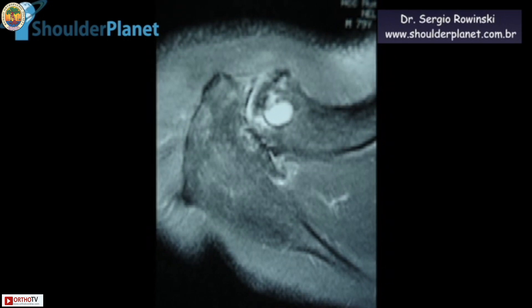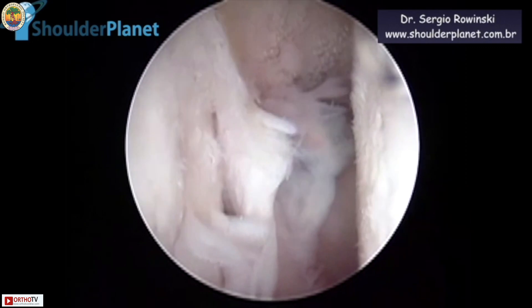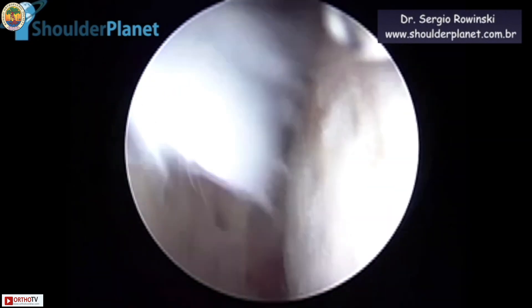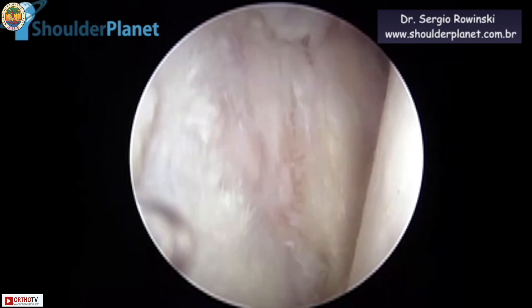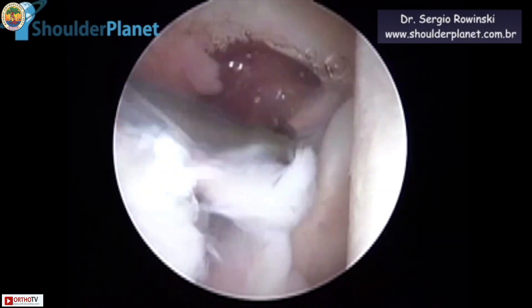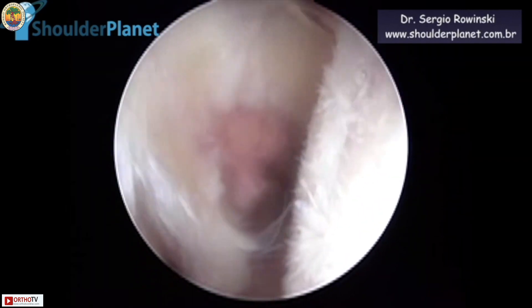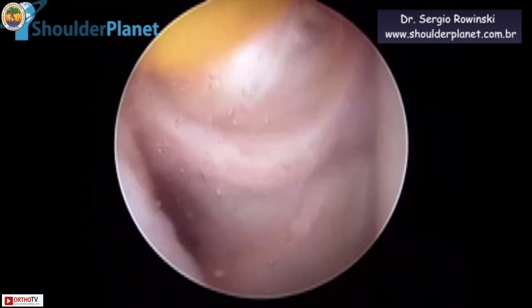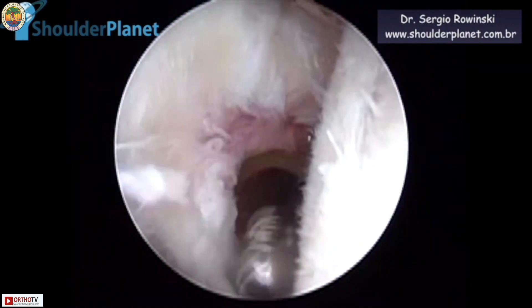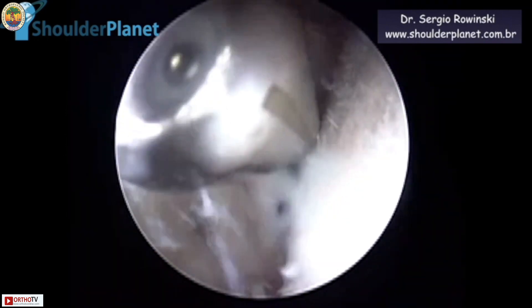First we are inside the joint. This is the right shoulder in which we can see a lot of degenerative tissue in the labrum, just above the biceps, with some fraying of the humeral head cartilage — quite normal at this age. We are seeing his labrum and biceps. We then established the anterior portal just above the very superior part of the subscapularis. We entered with a hemostat, placed our first cannula, and started to perform a slight soft debridement of the anchor of the biceps, cleaning not only the biceps but the posterior labrum too.